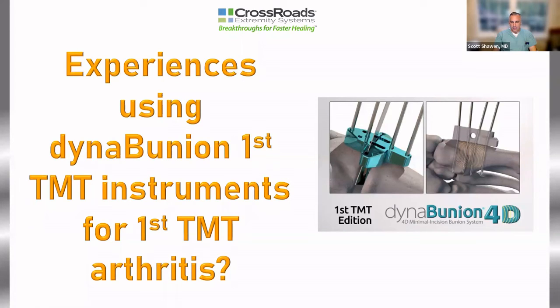Yeah, the only difficulty I've had is in a really arthritic joint, it's harder to get it loose. You really have to get the joint ligaments resected in order to get that paddle in there.